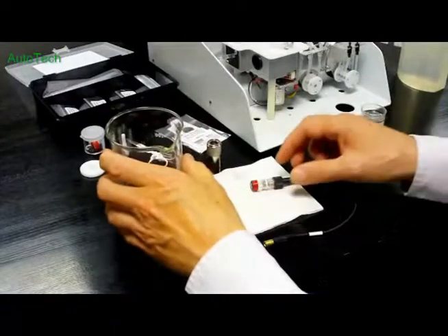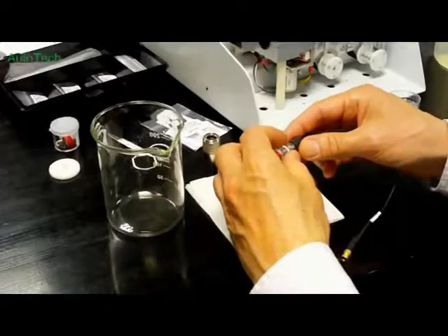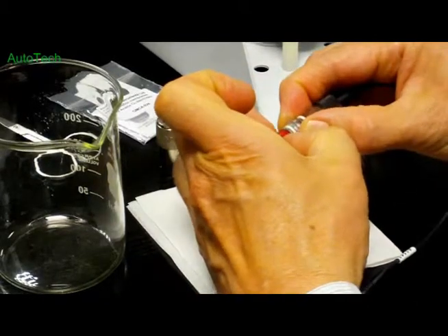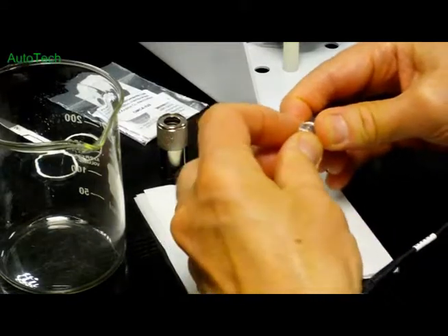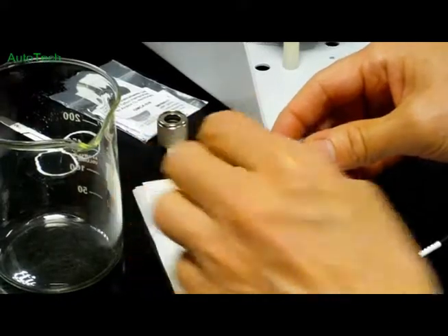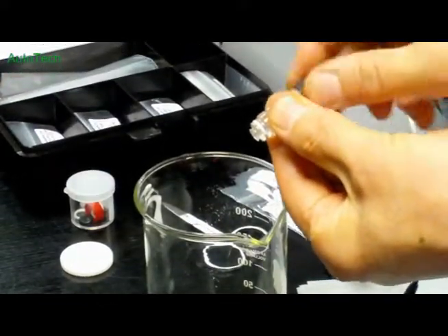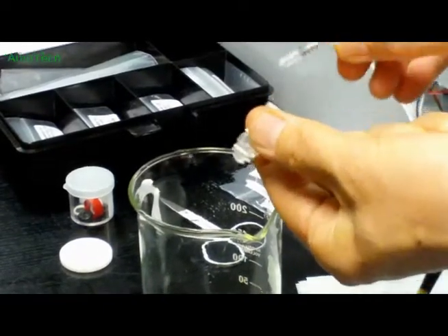So we'll need a suitable vessel to empty the contents of the electrode into, and start by moving the O-ring out of the O-ring groove and removing the end crown. And then you can also take off the membrane O-ring and at the same time remove the old membrane from the electrode. And now undo the knurled back nut, and at this point whatever electrolyte is left in the electrode will come out.